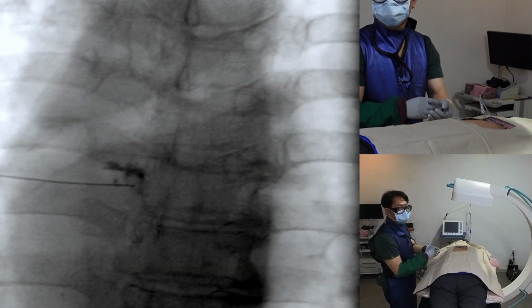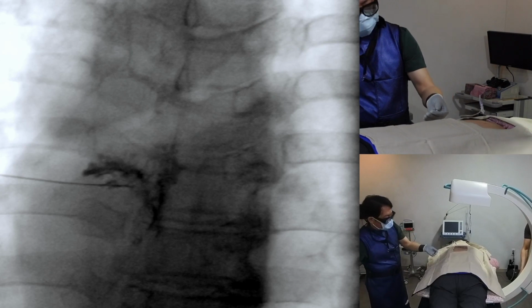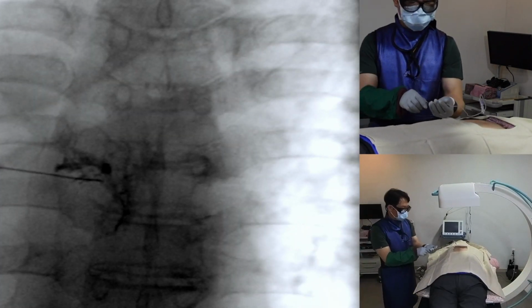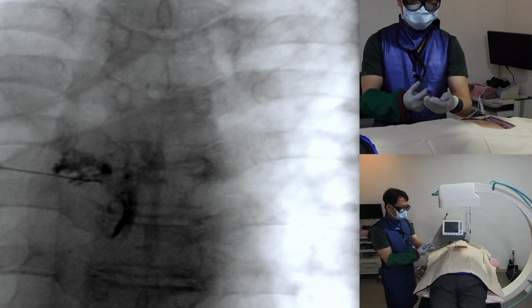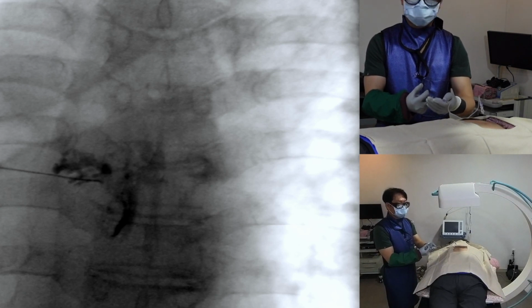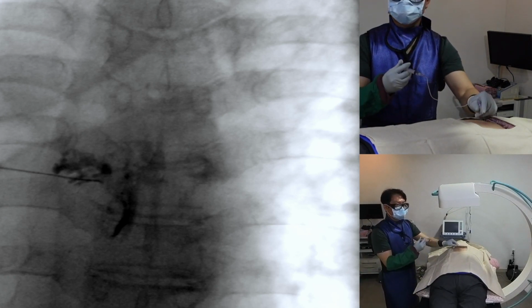Once the needle is positioned, I administer contrast media to visualize the transforaminal and epidural spaces. I carefully observe for vascular uptake and adjust the needle position to avoid intravascular injection of steroids. The intercostal spread of contrast media proceeds first, then opacifies the intervertebral and epidural space. I don't see vascular uptake and good contrast spread into the epidural space, so I will administer the steroid mixture. I will check the contrast spread during the injection process to ensure it fills the proper space.